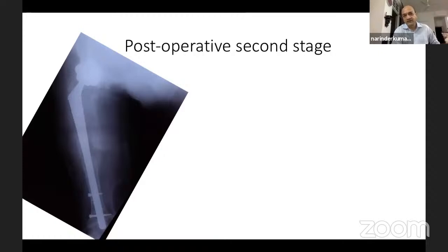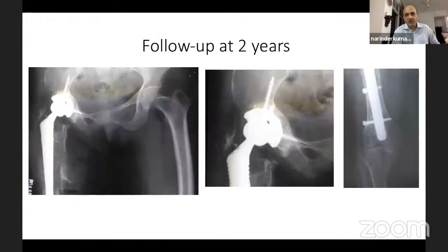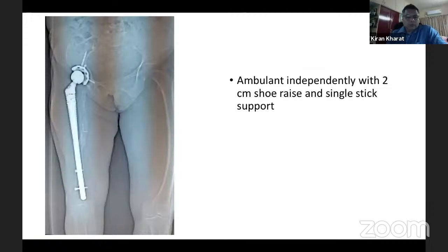And this is what we did. We did a gription cup on the top and a reef stem. And we did have a follow-up at 2 years only. After that, she was lost to follow-up. This is what she looked like. Yeah, that's a good bailout and very nicely done.